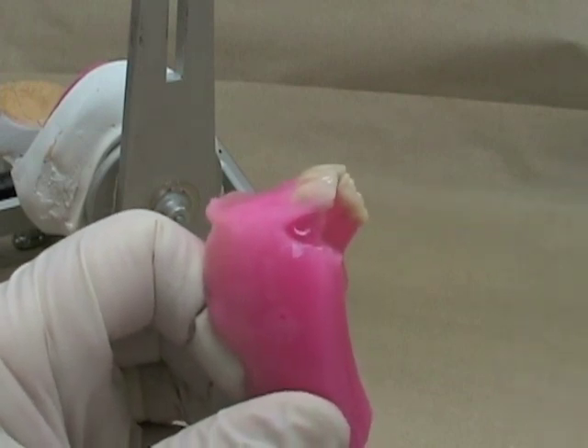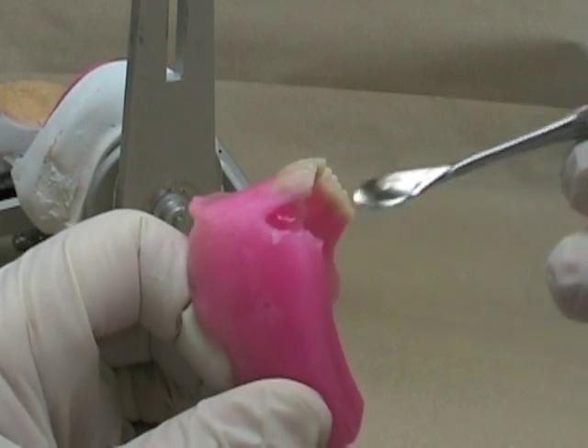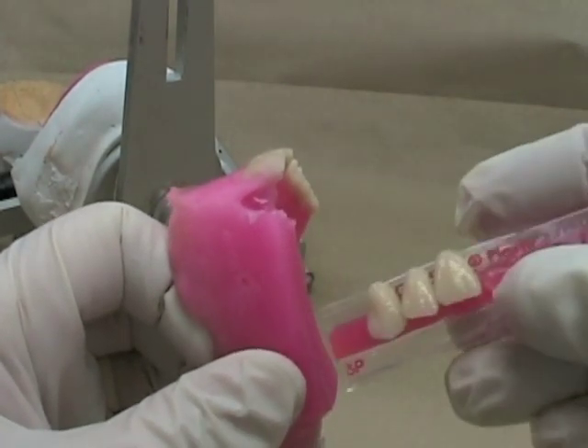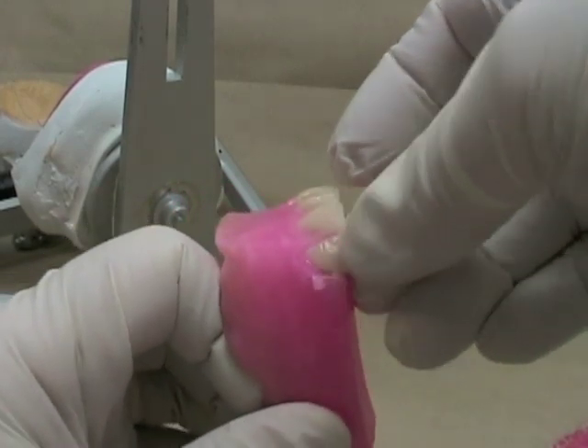I'm going to soften up the wax and get it into a molten state. You won't want just the surface layer softened — you want some of the wax underneath softened as well. Then I'm going to take one of the teeth from my card, take the maxillary incisor, and try to sit that in there.